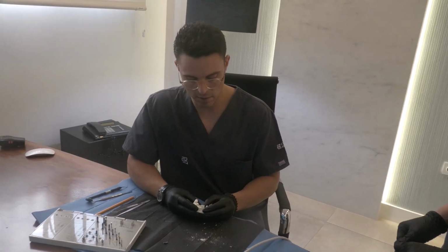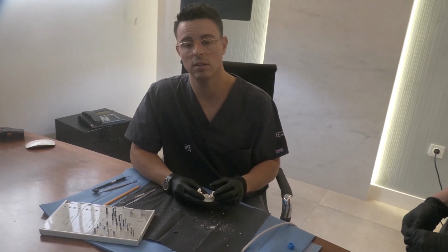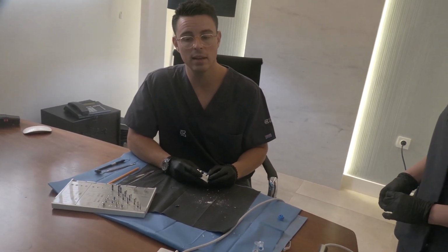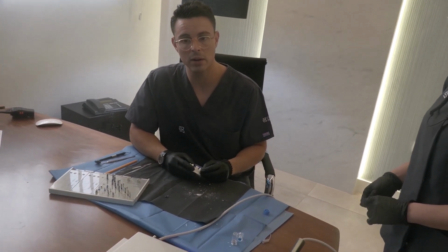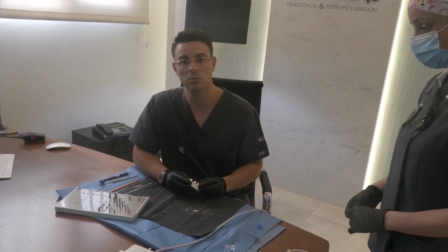I am confident that this has provided many of the tips in order to manage this special dental implant in an adequate manner, and that this will provide very successful and predictable outcomes in the long term.